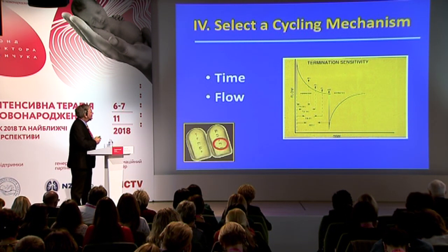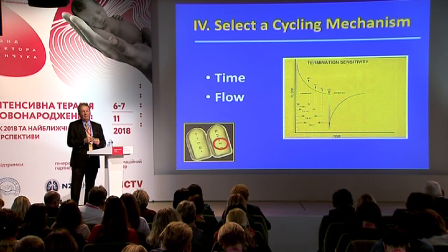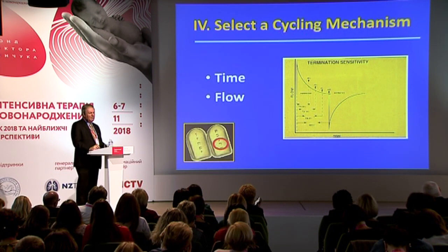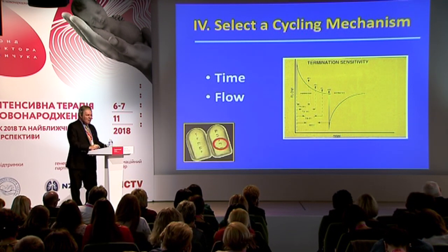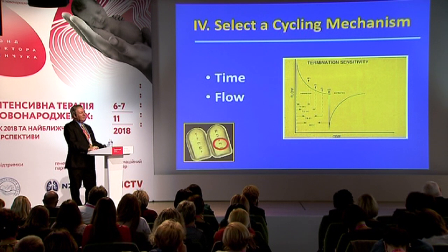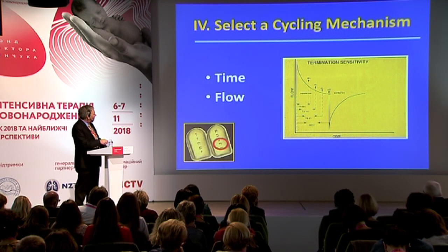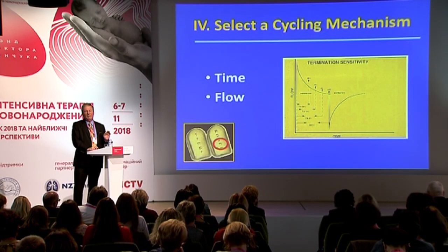The second reason is primarily for safety. And again, if you're using assist control ventilation, what happens if the baby starts to breathe more rapidly? Well, because you're going to end up with flow initiation and flow termination in flow cycling, the more rapidly the baby breathes, the shorter the inspiratory time will become.